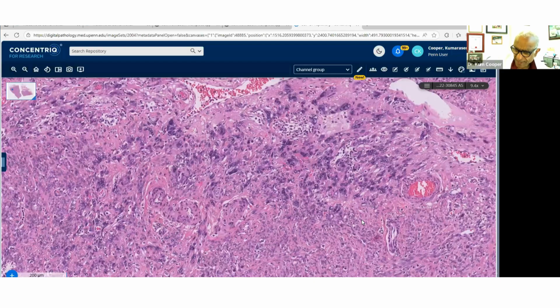So I like the suggestion that is put forth: atypical leiomyoma with bizarre nuclei and endosalpingiosis. Except the endosalpingiosis is typically not really within smooth muscle. And so the question that came up was, is this endosalpingiosis or is this an adenomyoma? You can debate it. It's both benign.